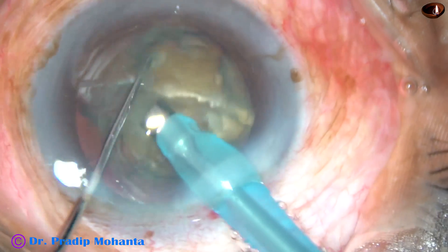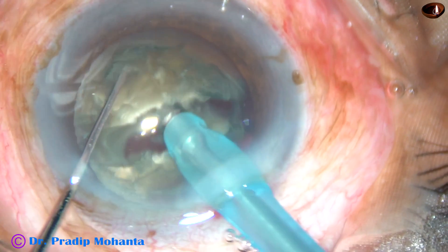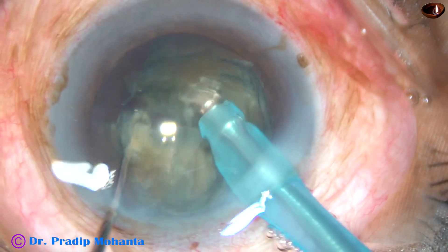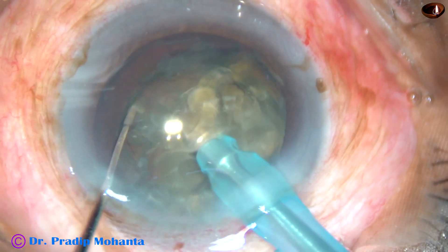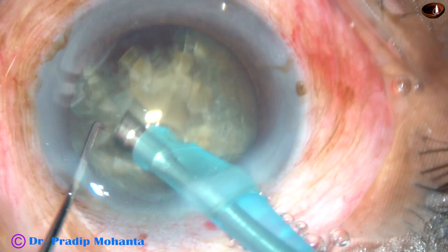Make two sculpts to remove some more lens matter. And now I divide the nucleus into two halves. Now each hemi-nucleus is again divided into two pieces. And then they are also subdivided if needed.